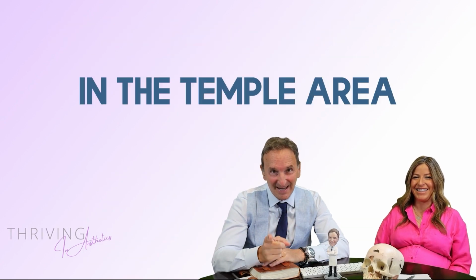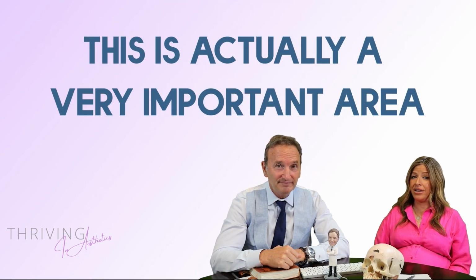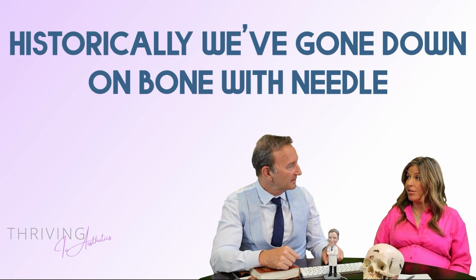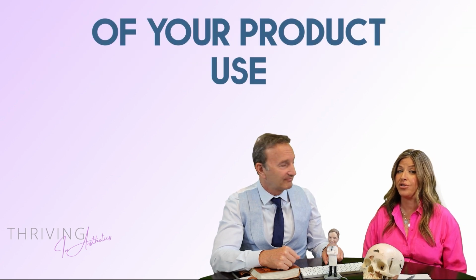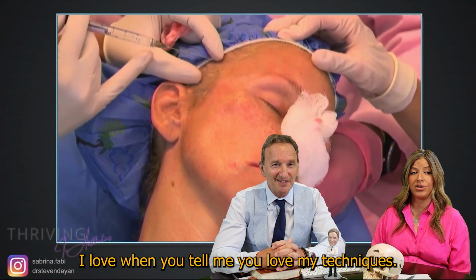All right, I'm going to show you how to thrive in 3 minutes in the temple area. Not an area easy to treat. No, this is actually a very important area, and historically we've gone down on bone with a needle, and I feel like you don't really get a good surface coefficient of your product use when you do that. So I really love your technique. Walk us through it.